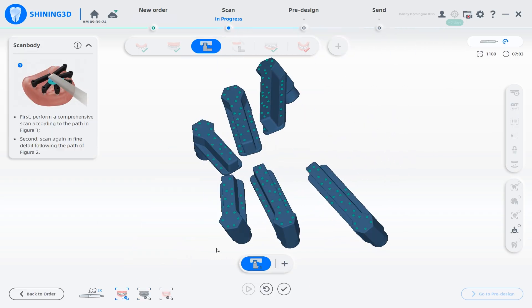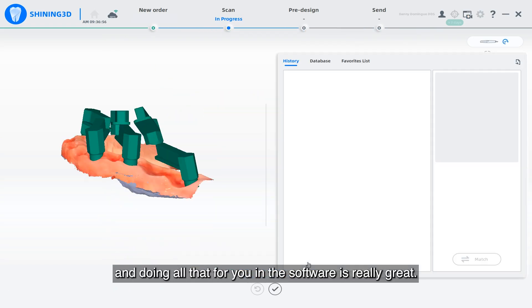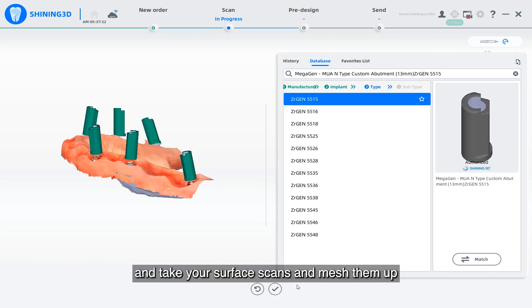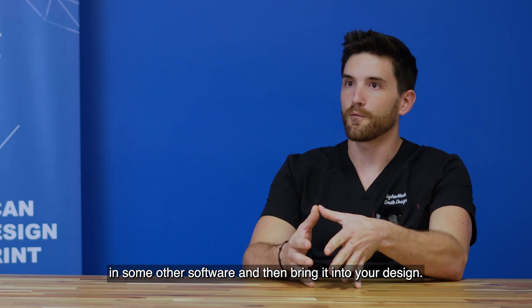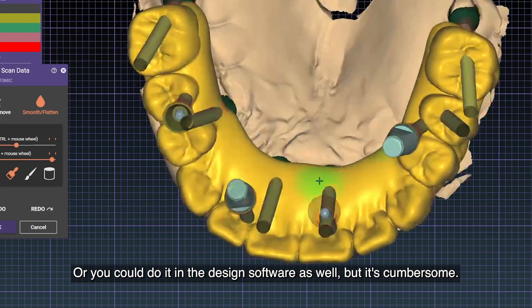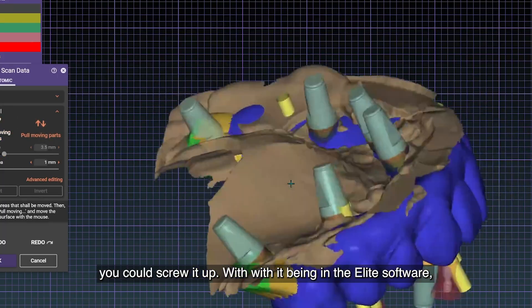With the Elite, it's aligning the steps and doing all of that for you in the software, which is really great. Before, you had to take your photogrammetry and your surface scans and mesh them up in some other software and then bring it into your design software — which is cumbersome, and there's a chance you could screw it up.